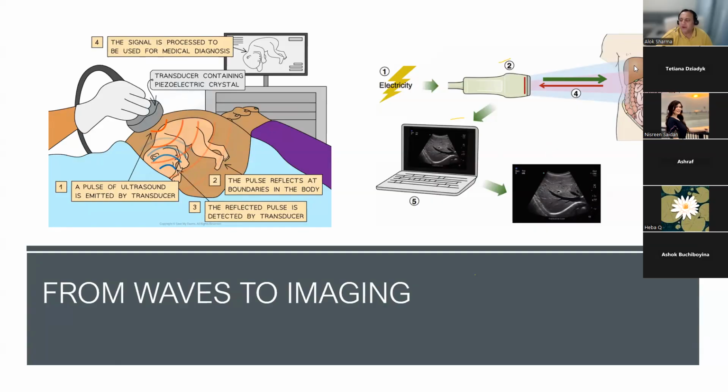If it interacts with solid tissue, you're more likely to see a tissue-like effect. On the other hand, if you've got air or fluid, you will have different patterns. And often with air, what will happen is you'll get what we call artifact, as opposed to the kind of tissue anatomy that you generally see.